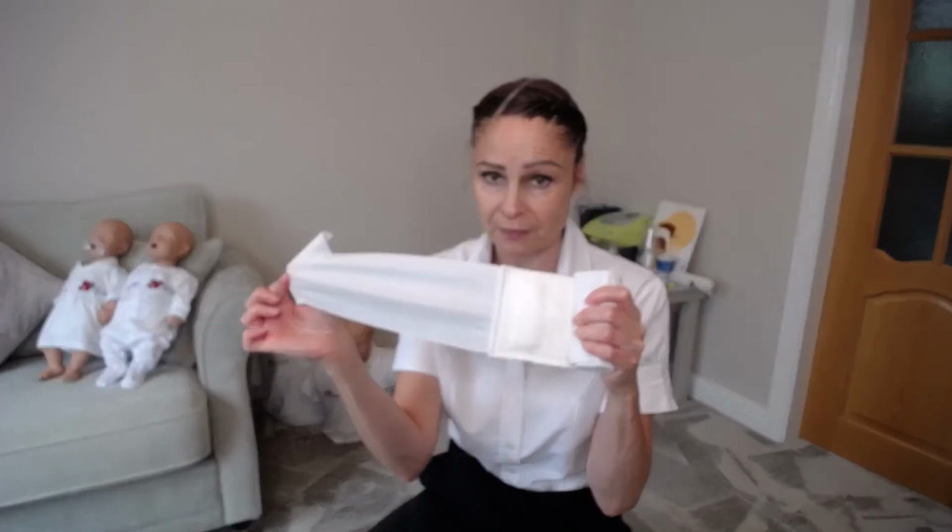The dressing that's recommended for more serious bleeds is something called the trauma fix or the pressure dressing. And these allow you to apply pressure directly and indirectly, and there are 2 types. So one of them, if you go to the actual pad in the middle, has a pressure pillow, which is a firm piece of material here which delivers direct pressure to the wound and indirect pressure from the actual dressing.